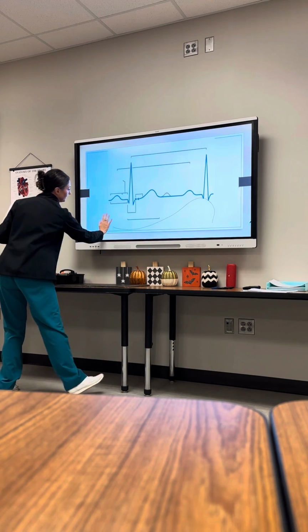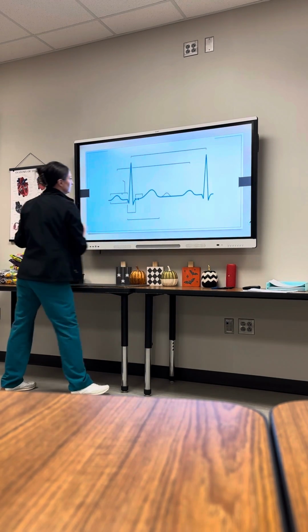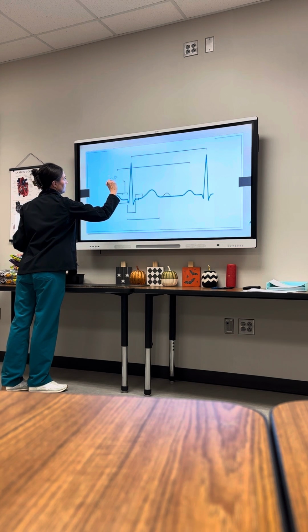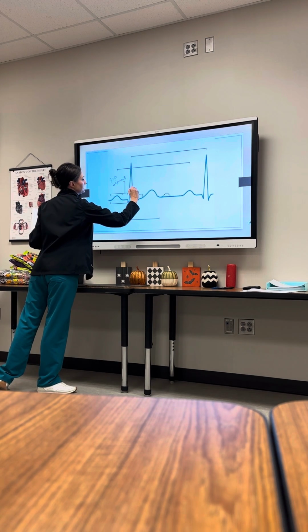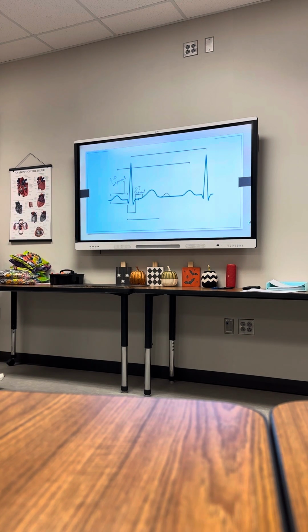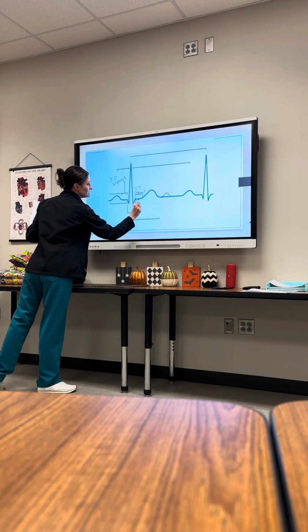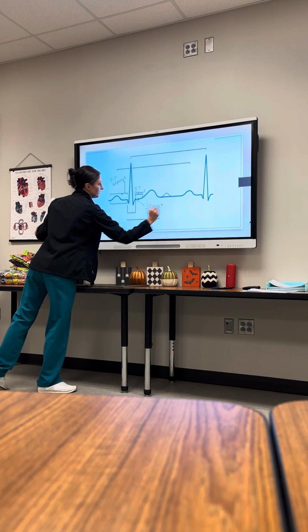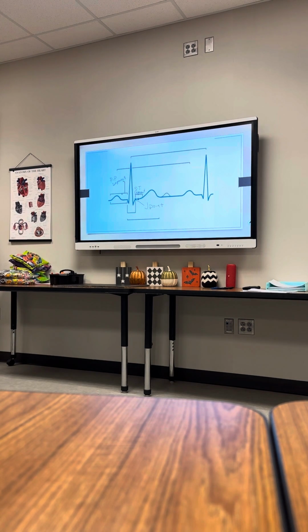So we did the PR segment here. Now let's label our ST segment here. And what else did I tell you about on that last slide? The J point. You do have like 2 little points here. We're just going to label the J point.